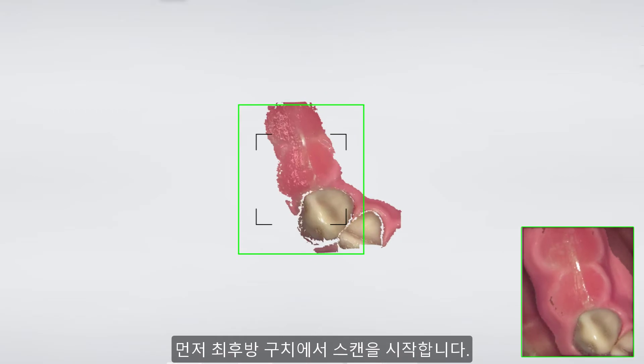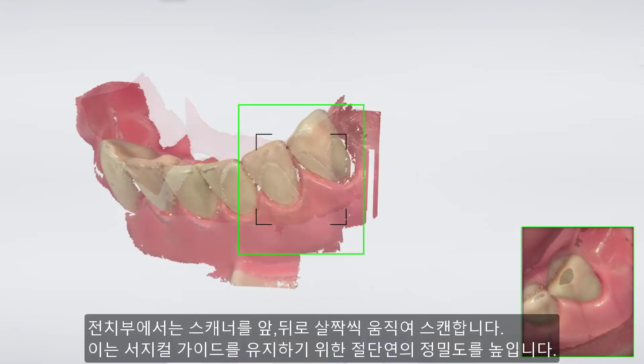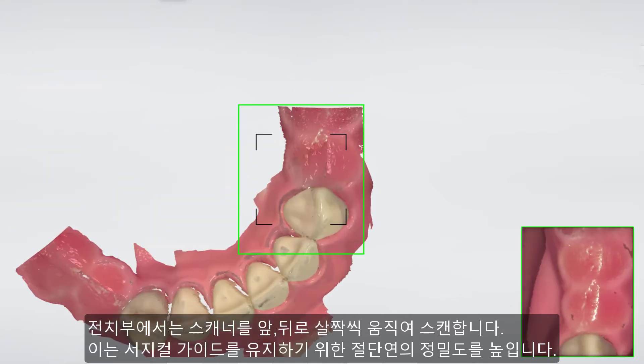Start scanning on the most posterior tooth. Remember to wiggle as you scan the incisors — this will give us the required precision of the incisal edge to retain the surgical guide.